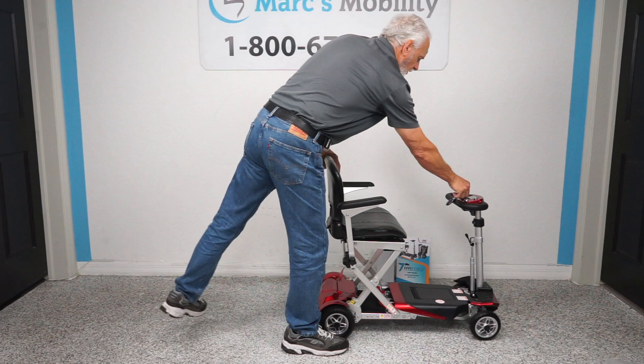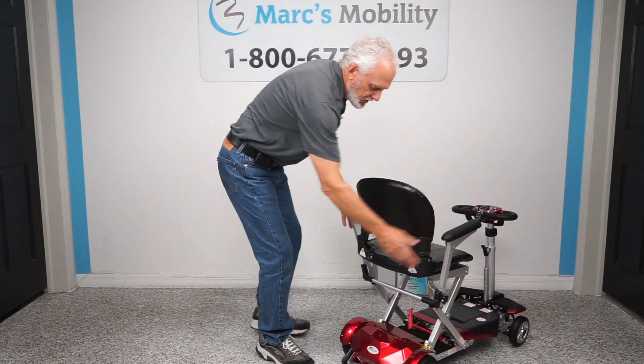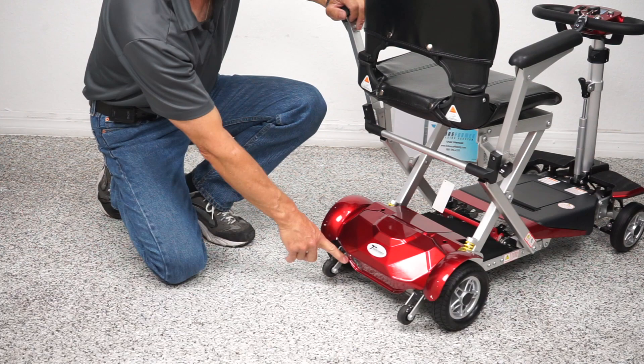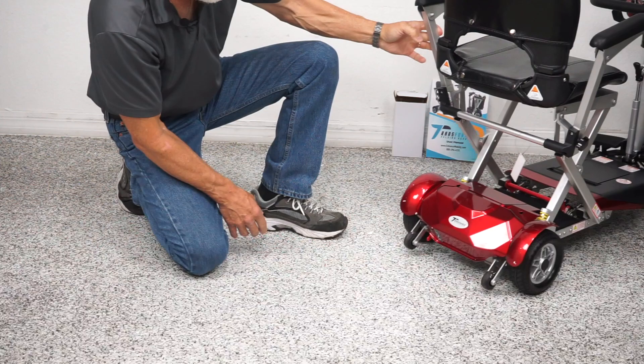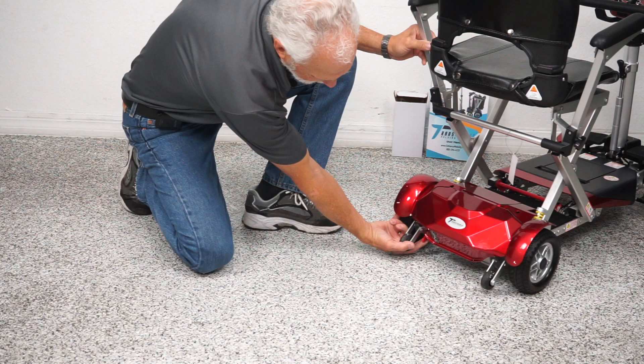Turn the power back on. You can see in the back of the scooter you have anti-tip wheels. You have a lever right here — if you turn the power off, the reason you want the power off is if you're going to put it in neutral so you can roll it. Push the lever down and now you're in neutral. Then push it back up and you're back in gear.